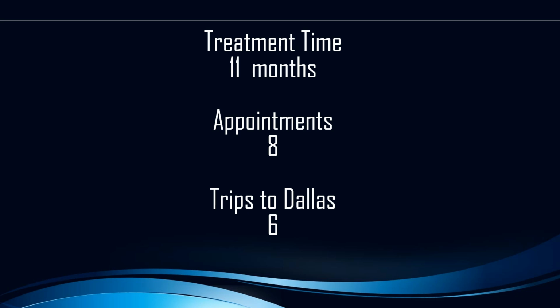So this case could have been completed in 5 months, but the patient needed 11 months financially, and sometimes, like I said earlier, we go even 2 to 3 years, as long as you're not breaking the temporaries and you can pay for it over a longer period of time. We are happy to accommodate that.